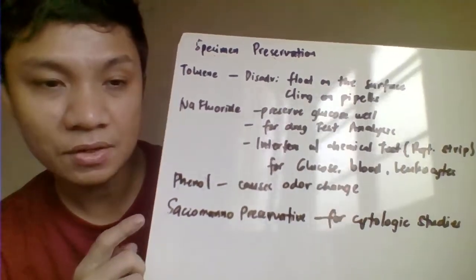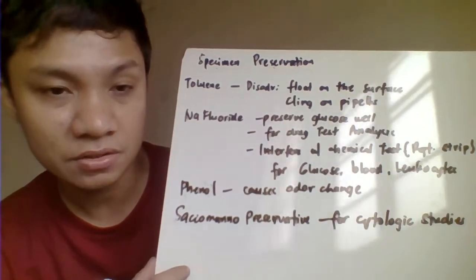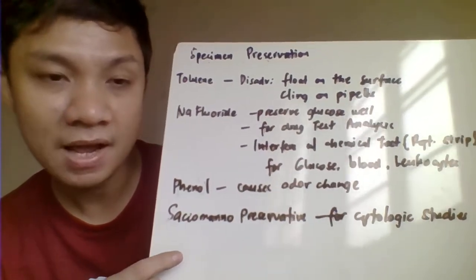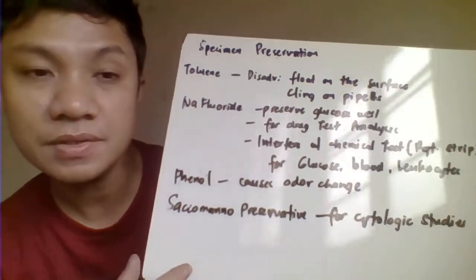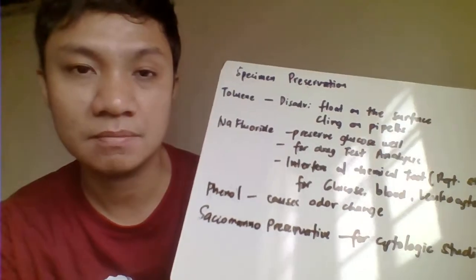Phenol, on the other hand, is also an excellent preservative, only that it tries to cause an odor change. And Saccomanno preservative is used here for cytologic analysis, for your histopath and many others.